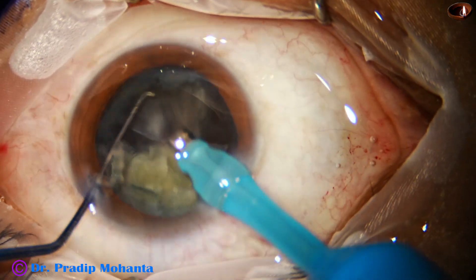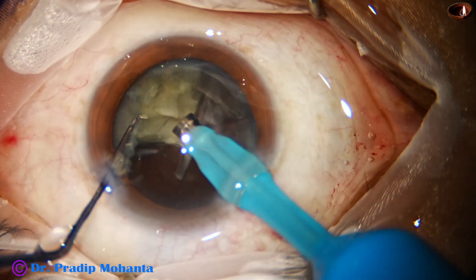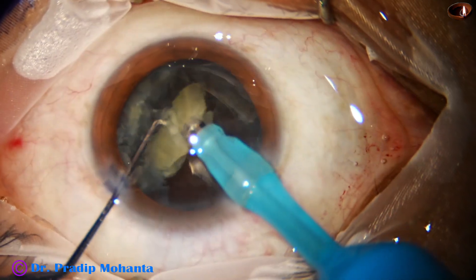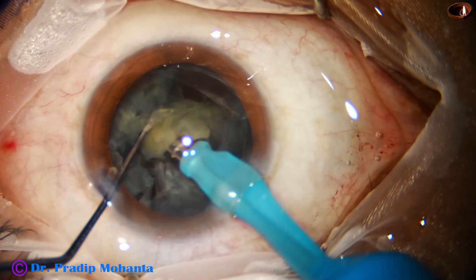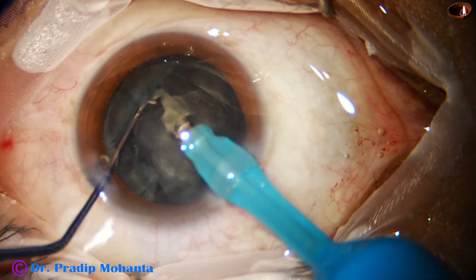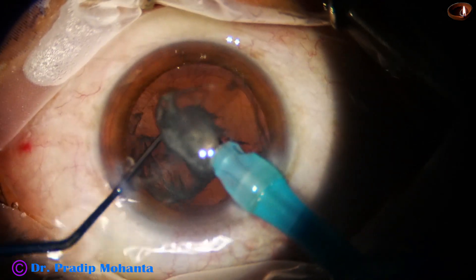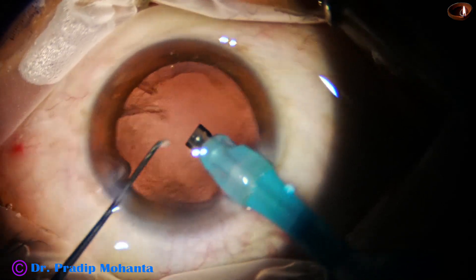At this time I am not going to remove this epinucleus. Let it protect — let it act as a cushion to protect the posterior capsule. And this is the last part of the nucleus. The epinucleus has been detached completely, and at the end, with low vacuum and low flow rate, this epinucleus shell is removed.